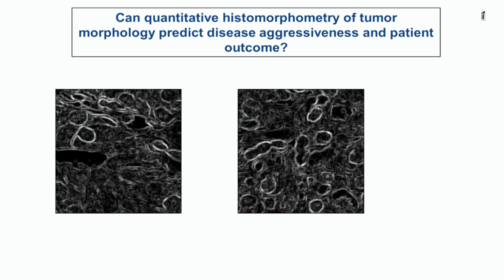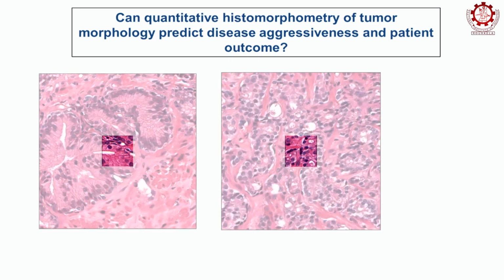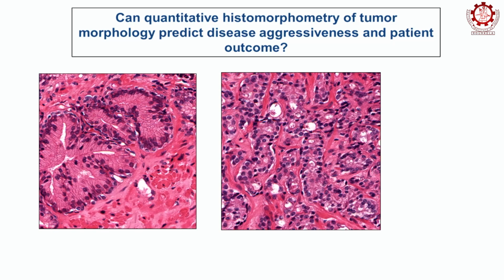So you can have graphs, you can have grayscale features. By grayscale features, I mean intensity based features. You can have texture features. And so there was this question about what magnification, right? Pathology images are collected at multiple different resolutions. You go from 5x all the way to maybe 40x, 100x, 120x. At different scales you observe different structures.